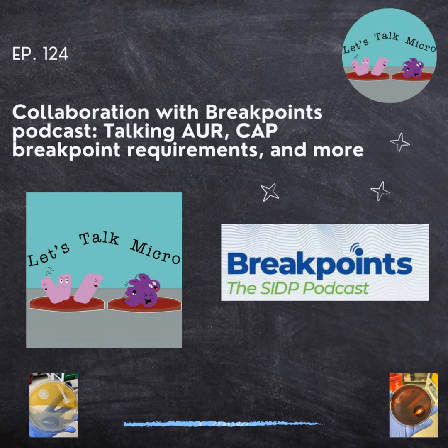We need to make sure that when we make the change in our automated system with the new interpretation of the new breakpoint, and we run the isolate again on the automated platform, the automated platform is able to assign the correct interpretation and replicate the reference method, that in this case is disk diffusion.